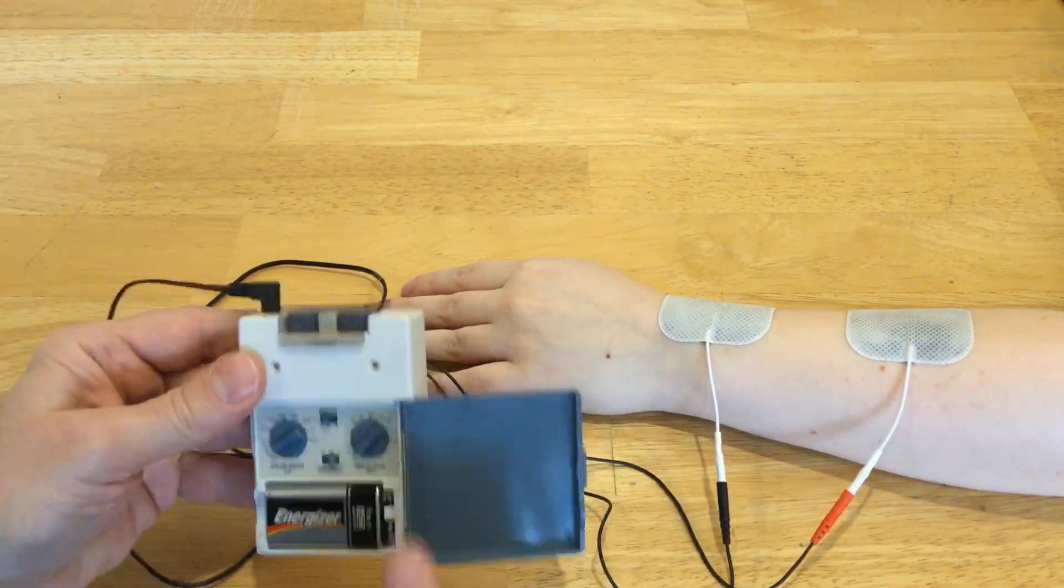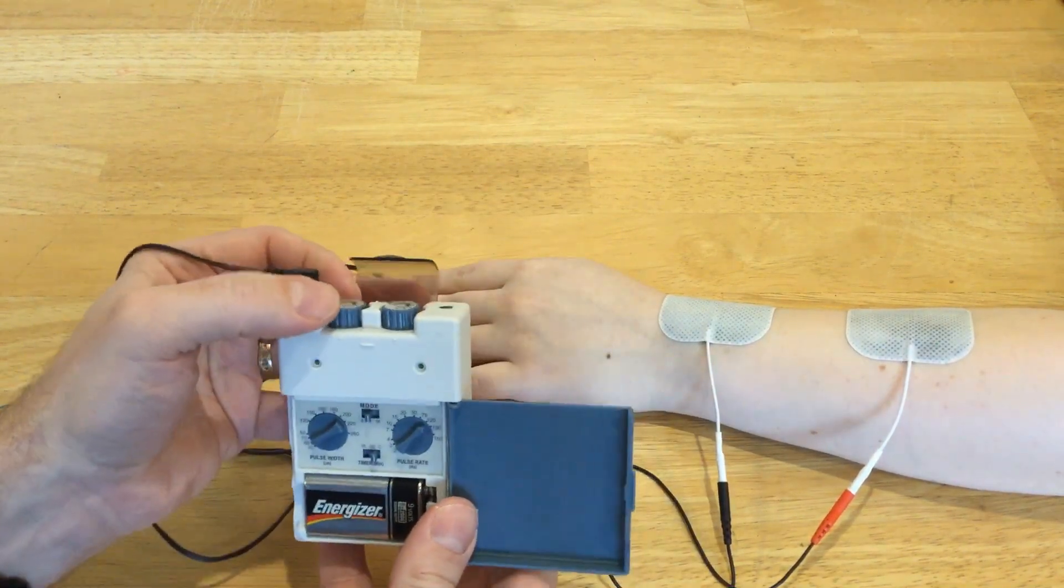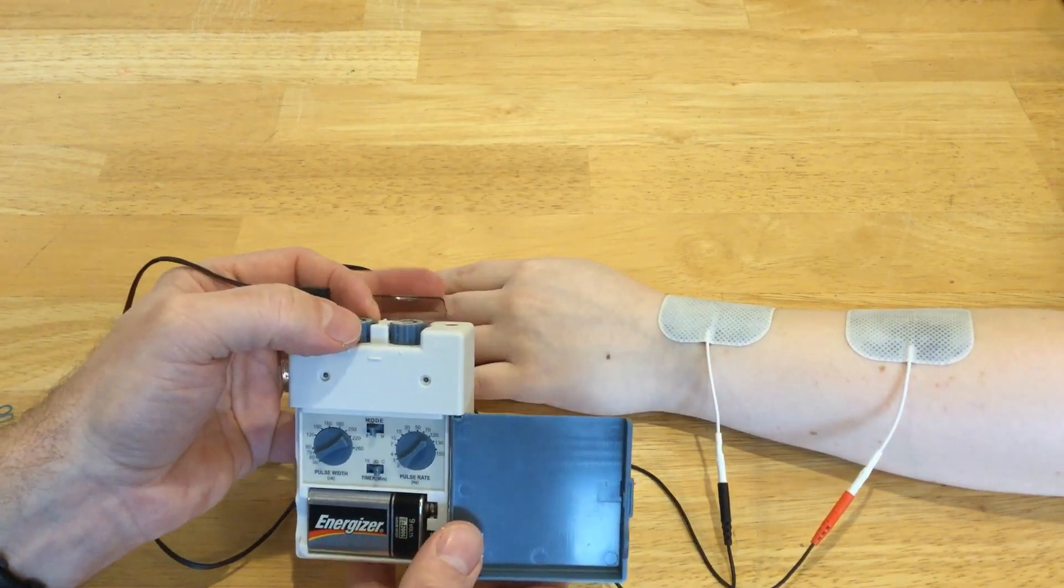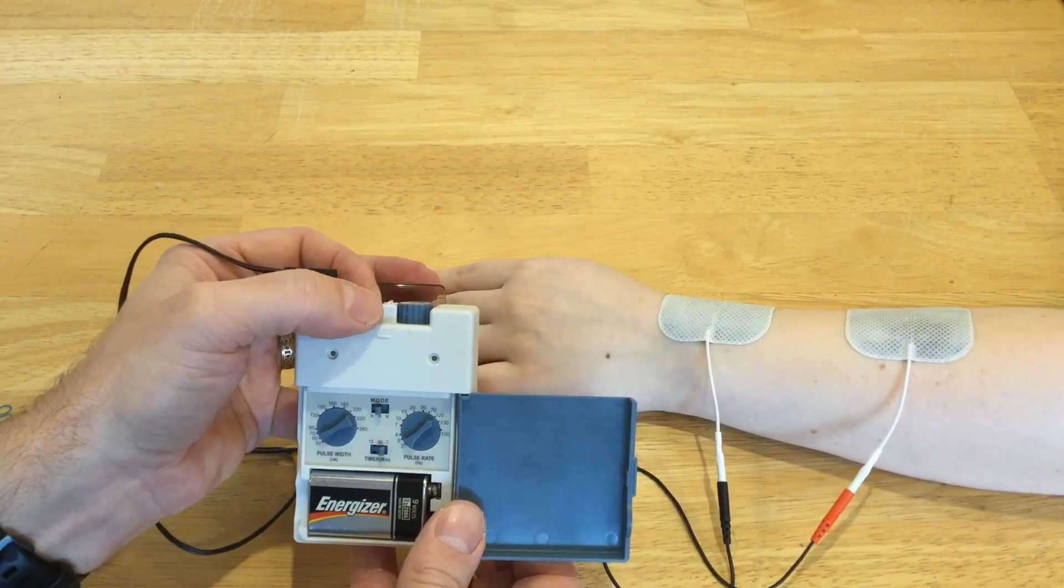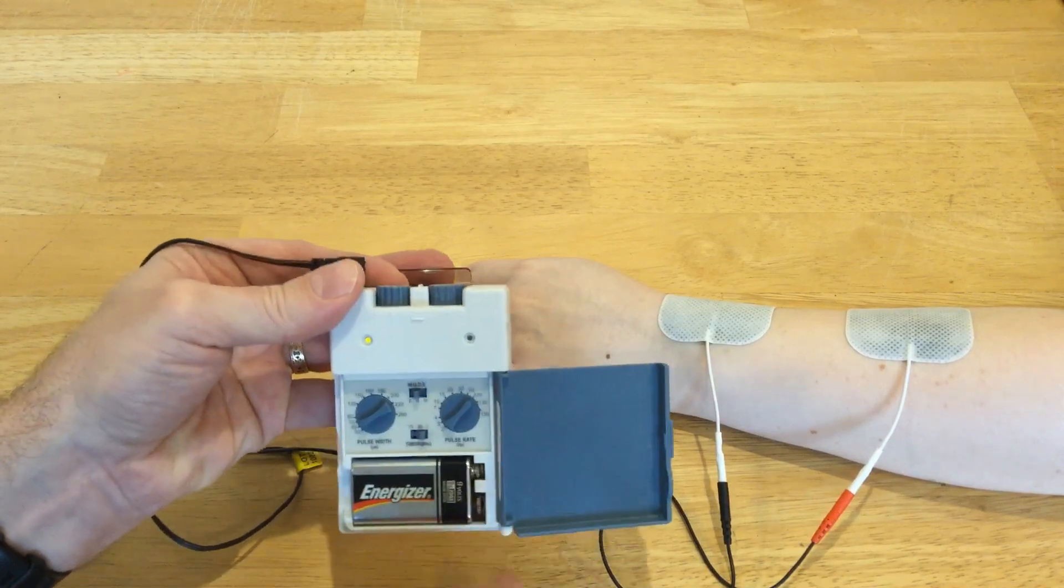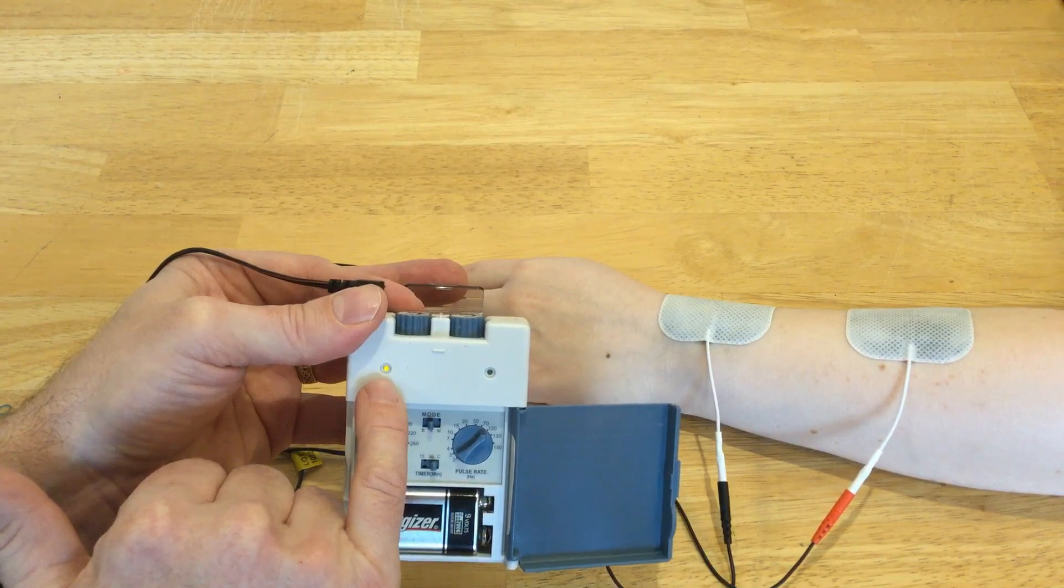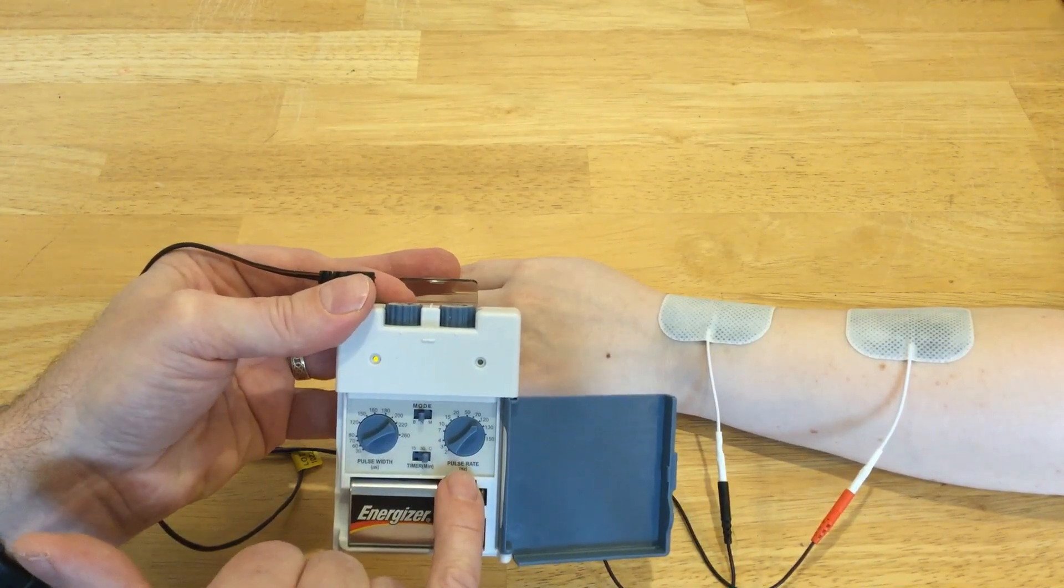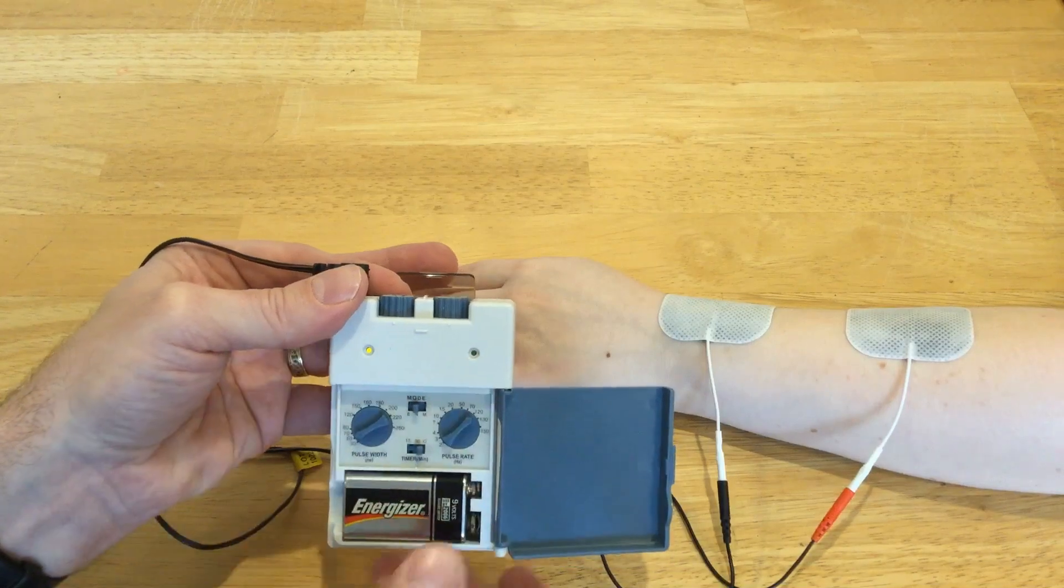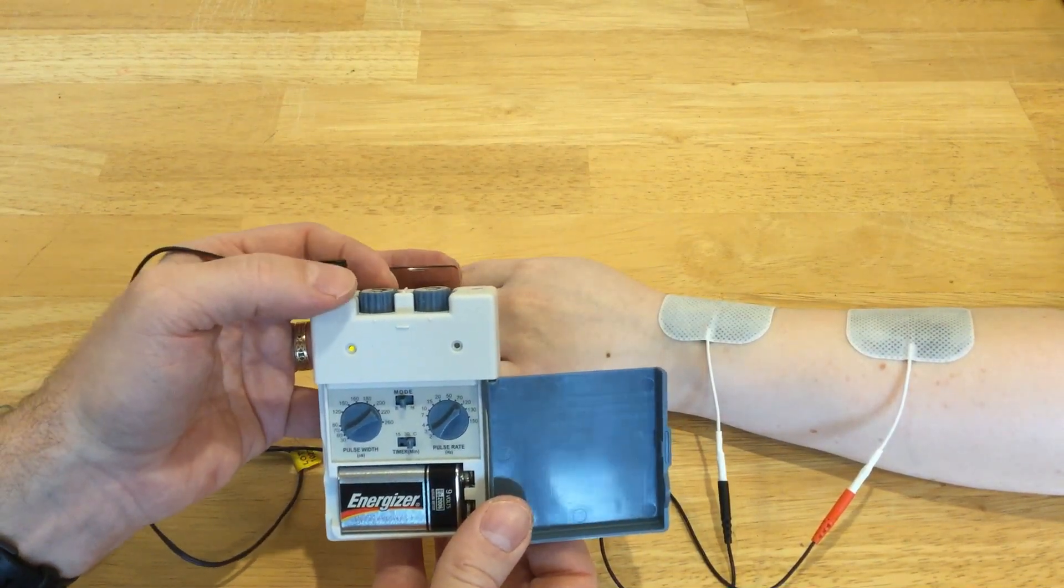Now what I'm going to do is turn it on by turning the dial and then slowly turn it up. My client will simply tell me when she first feels anything at all. You'll notice that when I turn it on, the little LED indicator goes on. And that actually flashes according to the pulse frequency or pulse rate. Since the pulse rate is 120, it looks like it's continuous, but it's actually flashing 120 times a second.